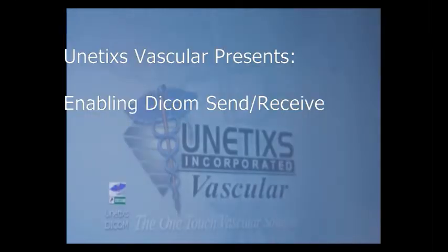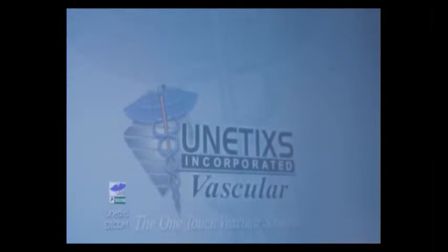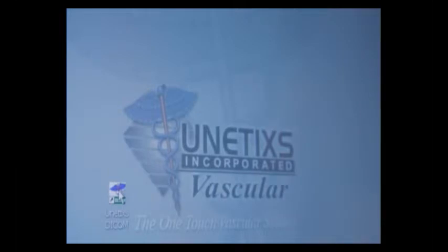In this portion of the video, we're going to talk about enabling your Multilab system to send and receive DICOM information. On your Windows desktop, which you can get to by pressing the exit button on your Multilab start screen, you will see an icon that says Unetix DICOM. Double-click on that with your trackball or mouse.